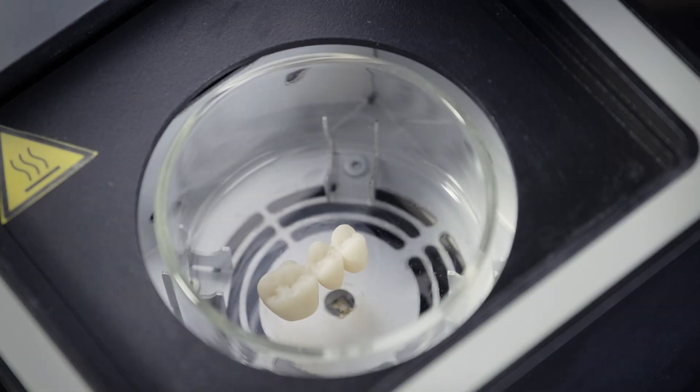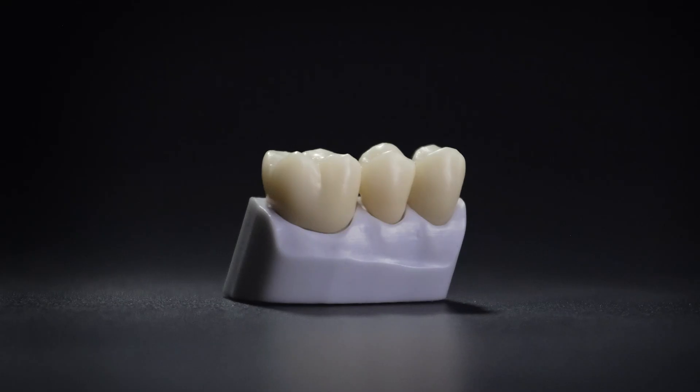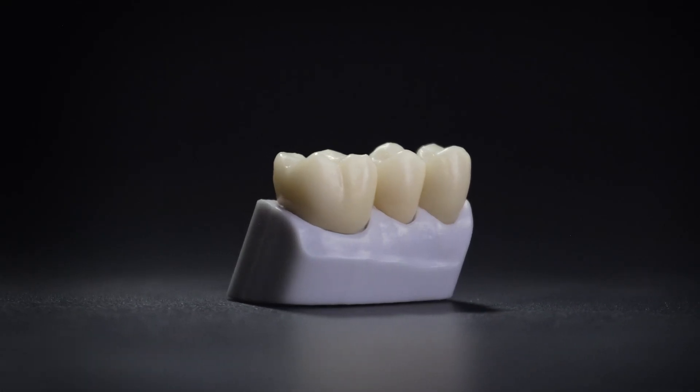At the end of the cycle, the upper lid of D-Cure opens automatically and the restoration is ready for application on the patient.